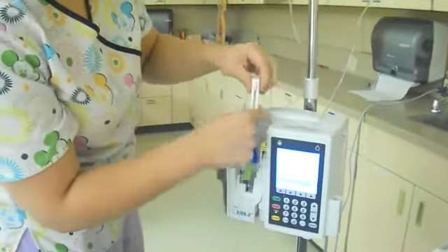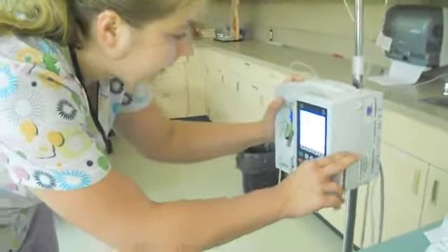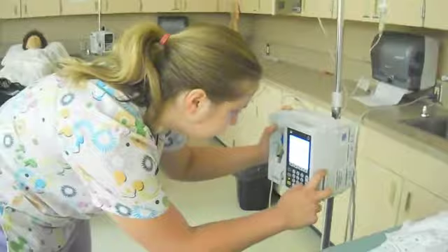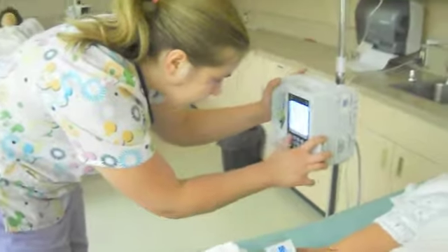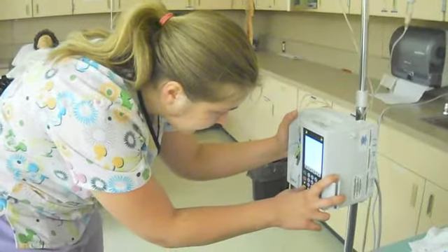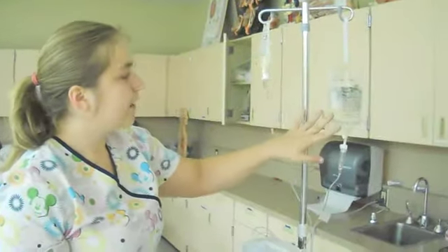Once it's connected you can loosen up that roller ball. I'm going to set up line B right now — that would be the piggyback line. The doctor's order has stated that he wants it running at 200 milliliters per hour. So I'm going to set the mode to piggyback because that's what the doctor's orders were — he wants it at 200 milliliters per hour, and it's also 50 milliliters volume. I'll enter that in. It tells you the duration is about 15 minutes, so there's no guesswork, and when you come back you can make sure it's all infused properly. We're just going to push start. Right now this line is running, and then once that's done, the main line will continue to run as well.